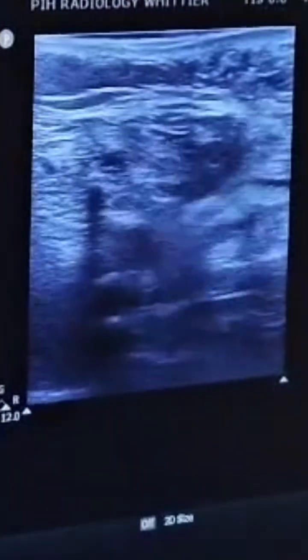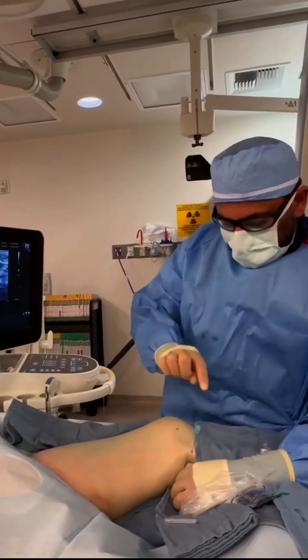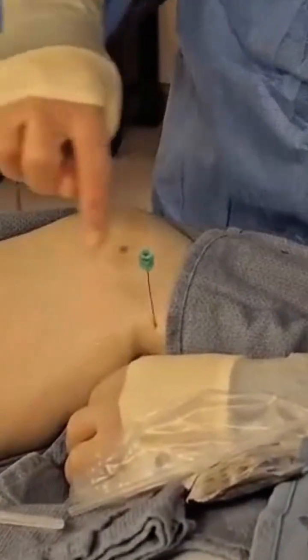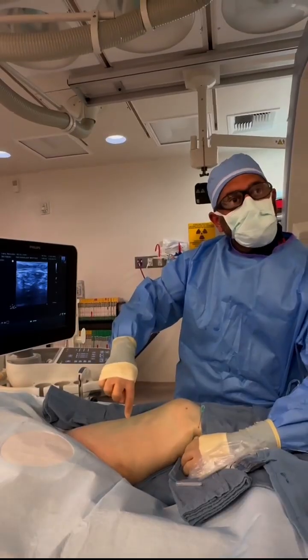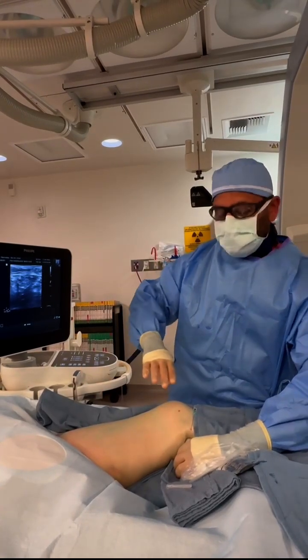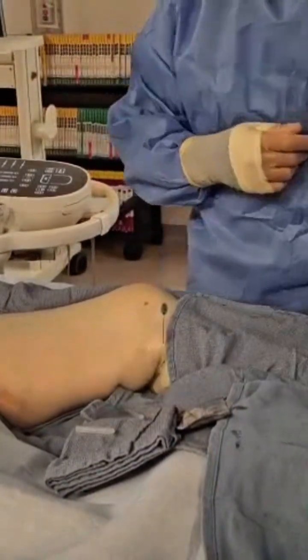Most people don't realize — you can see it on the video right there. So it's long. Even though with this pop you'd think it's going to be perpendicular to the vessel, the angle actually works really nicely and it'll be straight when you do your stiff wire. So you can see we're in and then we're going.